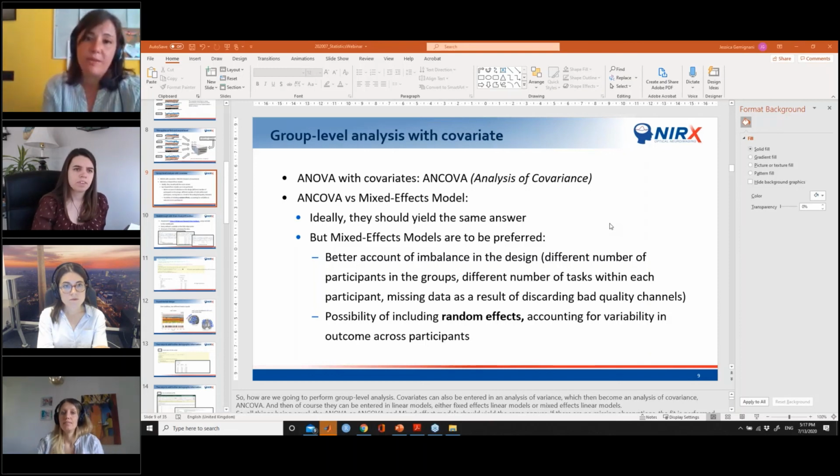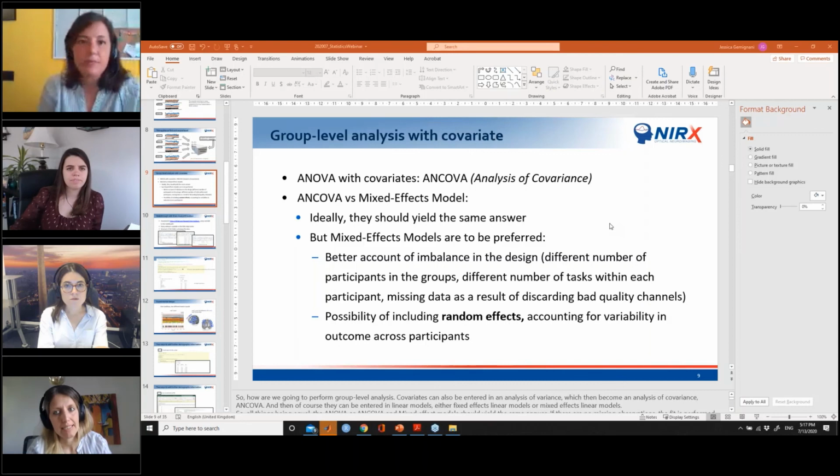also be informative, right? I definitely wanted to say the same. There are quite significantly different results if you use different DPF. And if the age range is very small, it wouldn't make sense. But in this case, as you said, it's 20 years, especially in the group 60 to 80, there may be a significant difference. So the question here was, should DPF or PPF be adjusted for each group?